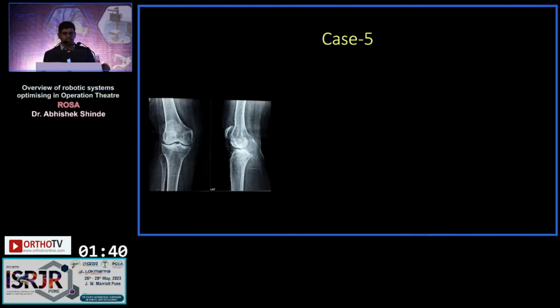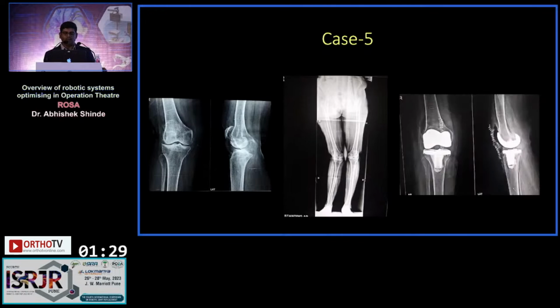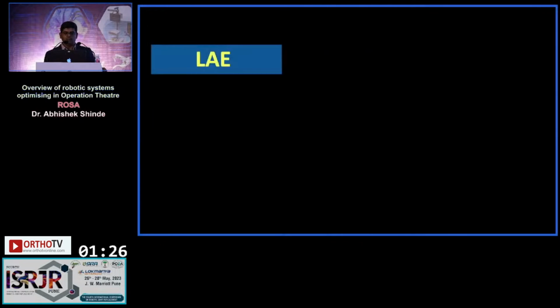This is the valgus case, an extreme valgus which I came across. This was almost 22 degrees of valgus, but it was correctable. Along with the valgus, she had a recurvatum deformity as well. This is her post-op X-ray.